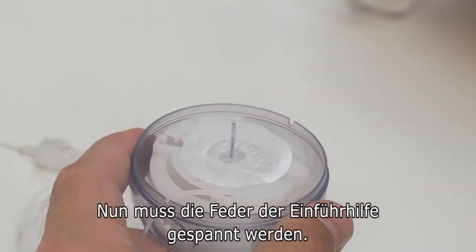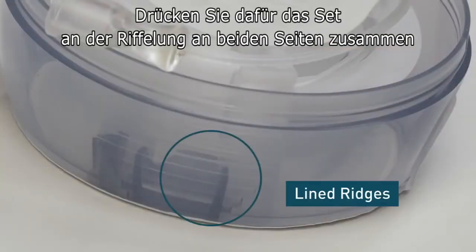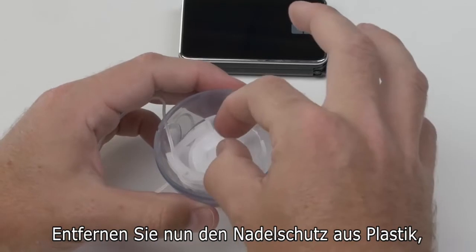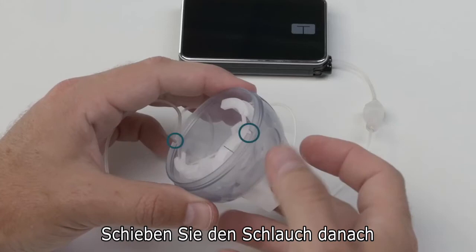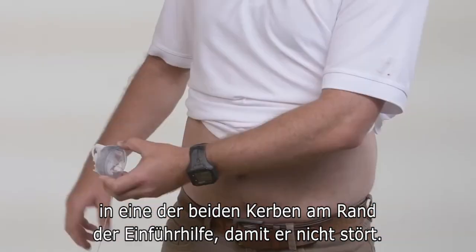After that, you need to cock the insertion device. To do this, place your fingers on the lined ridges on both sides and press in. Then grab right here and pull straight up until it clicks. Now, remove the plastic needle guard from the introducer needle by gently twisting and pulling it off. After that, slide the tubing into one of the two slots on the rim of the insertion device to keep it out of the way.